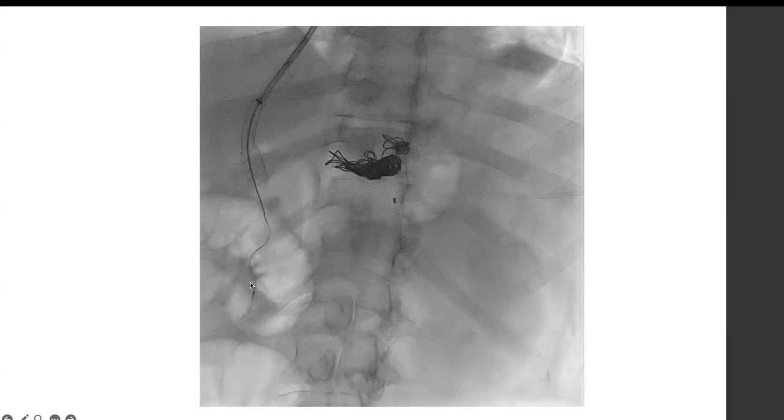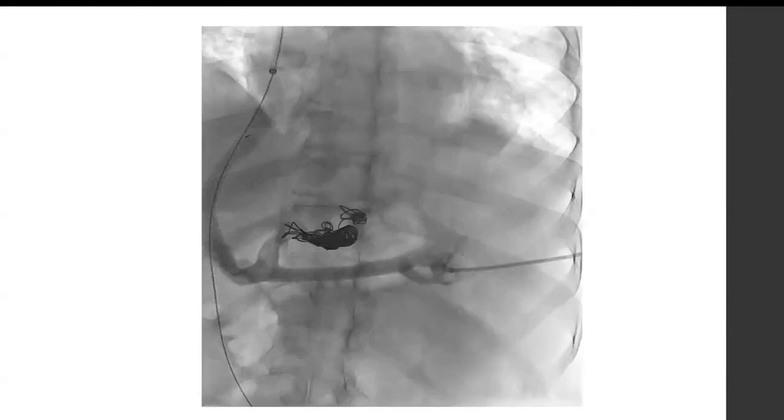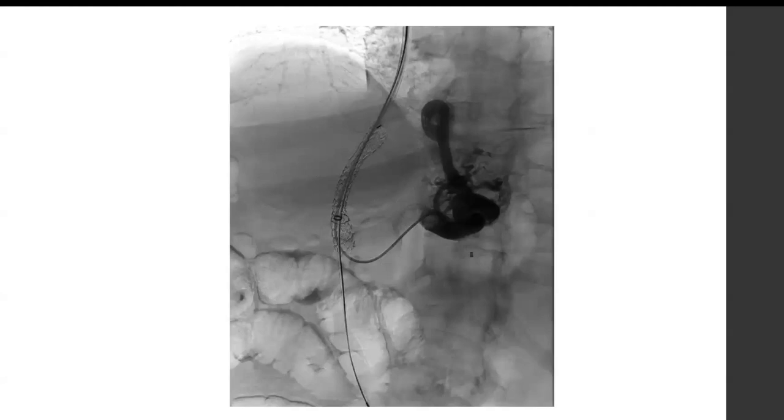So we use ways to clean it out. You can use this device here called a cleaner, appropriately named, and in this the wire spins around, it's bent and it spins around and breaks up the clot, and the clot just goes out through to the lungs. And so that's one way. That's a big way to treat acute clot. You can also aspirate it using one of many aspiration devices. We often use Inari, but those are pretty sizable, so you need to have a TIPS in place to do it. So that's acute clot. Additionally, or acute portal vein thrombus.